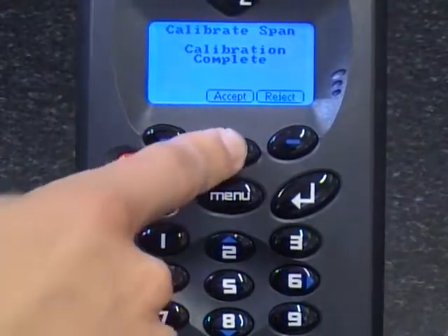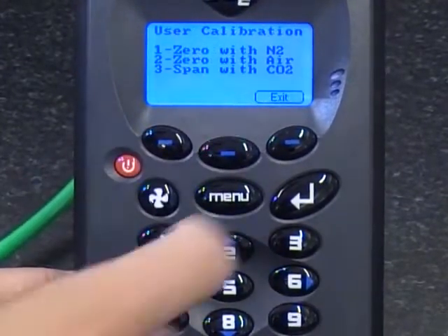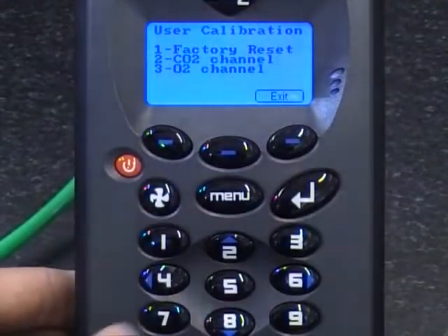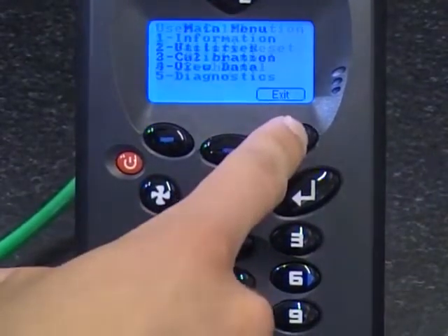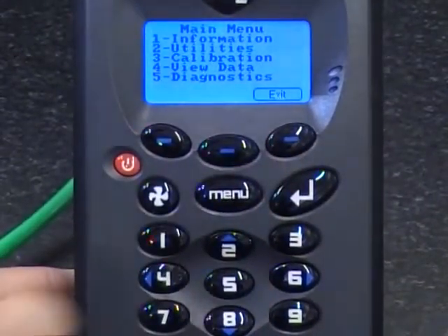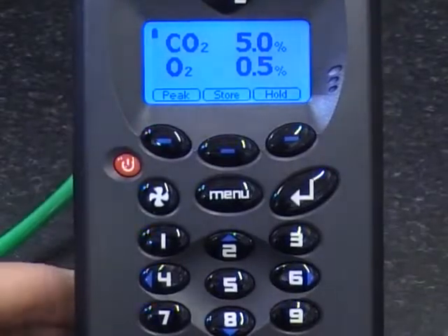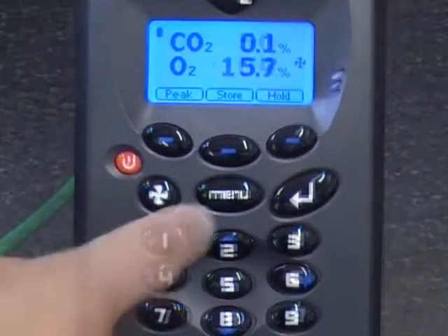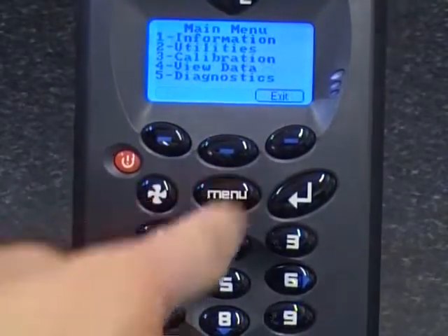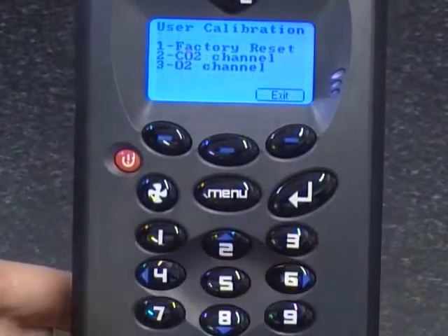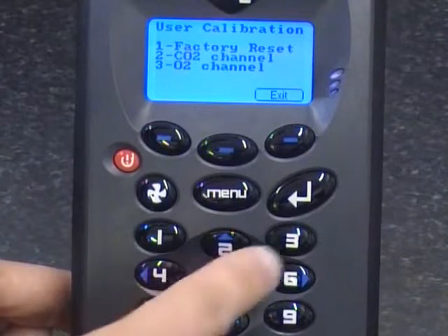Then simply press accept again and then exit all the menus and ensure the CO2 channel is reading the correct concentration. Go back onto the calibration option but this time select key 3, O2 channel.